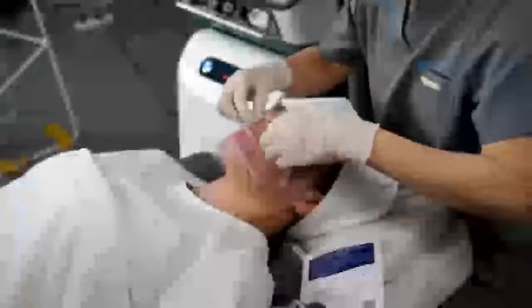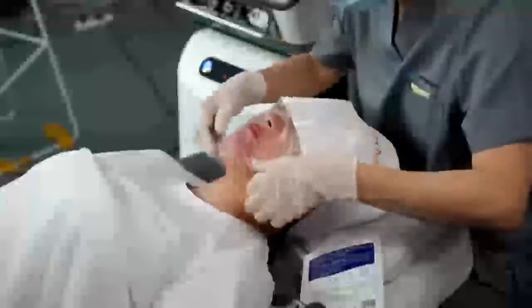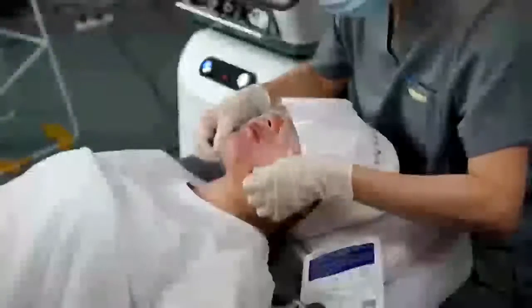After we finish the treatment, we'll give her a mask to cool down her face, her skin. And after you finish the treatment, you need to avoid the sunshine.